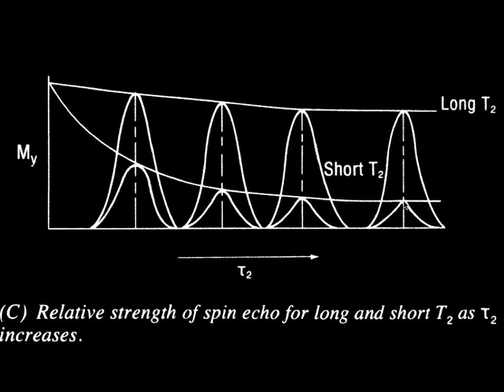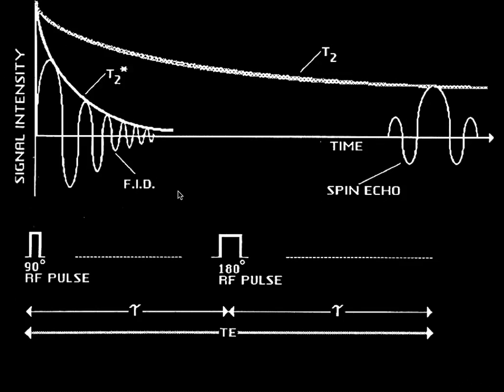If we go to 3T, it turns out we can get very good separation at lower TEs. And the lower your TE here, the higher you're up on the curve and the better signal to noise you get. So typically in the musculoskeletal system at 3T, I like to get a T2 sequence with a TE of about 60 milliseconds. If you go longer than that, you just lose signal to noise and you don't gain any contrast. So around 60 milliseconds for a T2-weighted image at 3T.